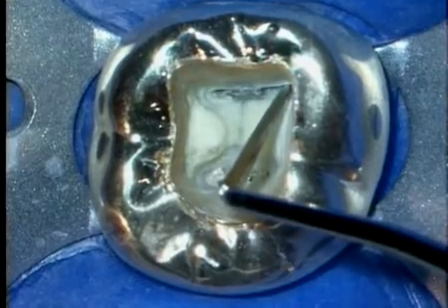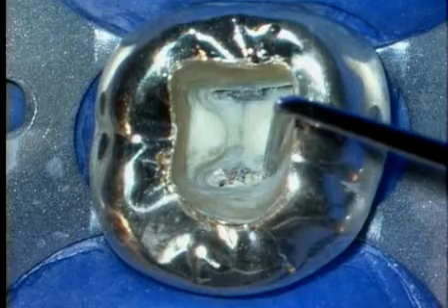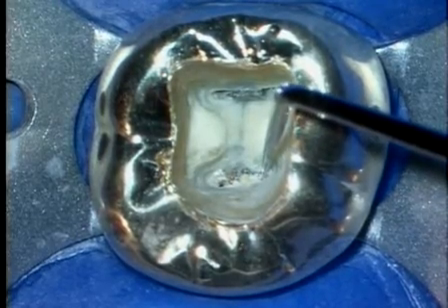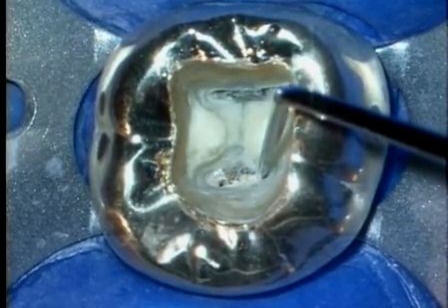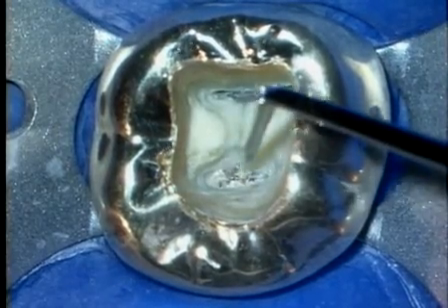Many dentists regretfully begin to instrument canals at this point. For me, there's still quite a bit of work we can do to set up our cleaning and shaping. Here's a free denticle. These can be teased up and blown out with air. And sometimes there'll be projections of denticles extending down into the canals. If we're careful, we can tease these up as well so that it'll free up the canal so we can begin our cleaning and shaping.